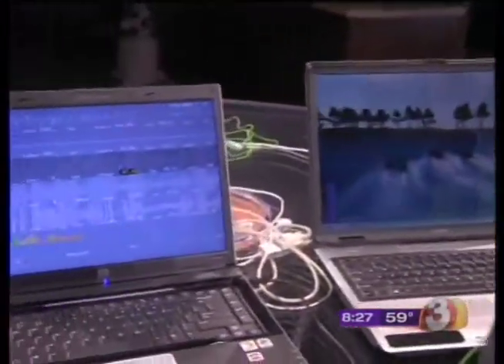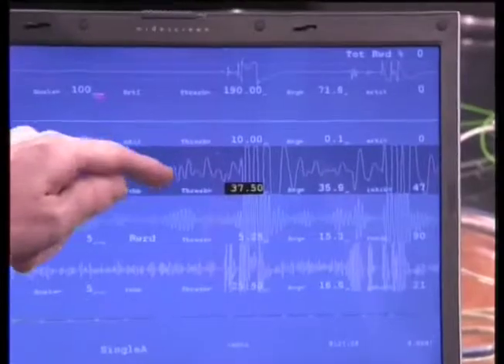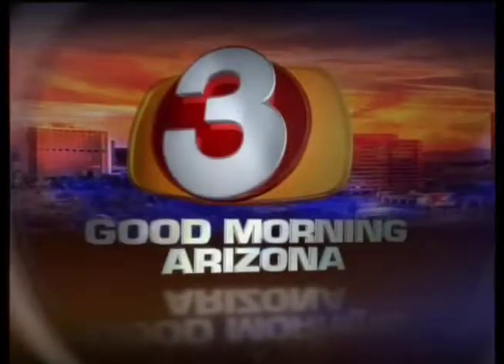You look really great. Can you keep those on for the rest of the show? I have a brain. Yeah, watch this one second. I'm just going to show you. Watch that number. And just calm focus and watch the number go down. And watch your wave change. See that? That's the voltage of how much theta. See it change here? You're keying your brain in right now. And I teach people to do that. Now, as you do that for 15, 20 minutes, you will feel.